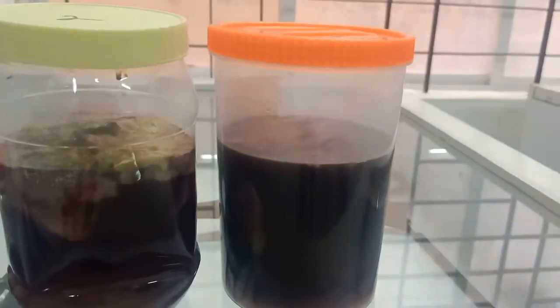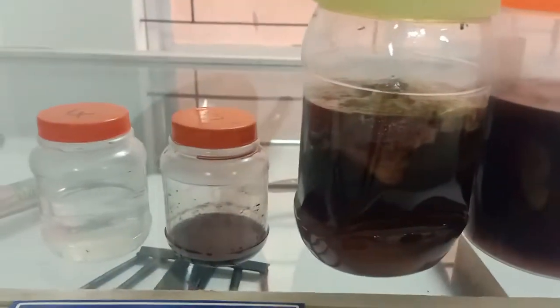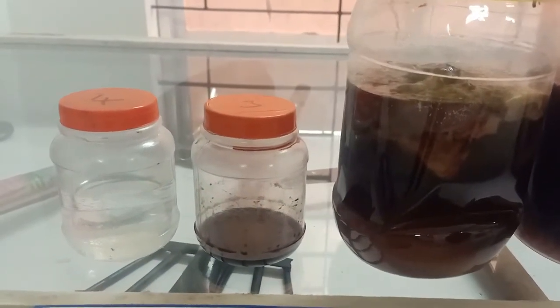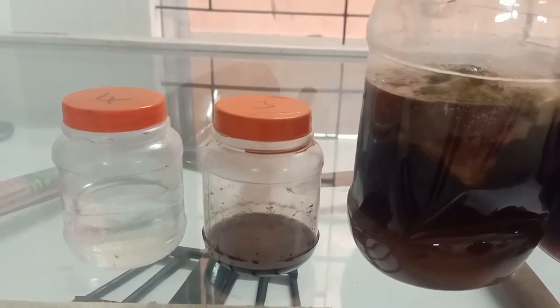Saturated sodium chloride solution is the preservative used in bottle number one and bottle number two. For bottle number three, the preservative used is a combination of sodium fluoride and potassium oxalate.